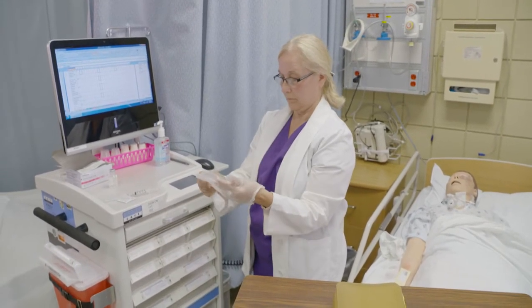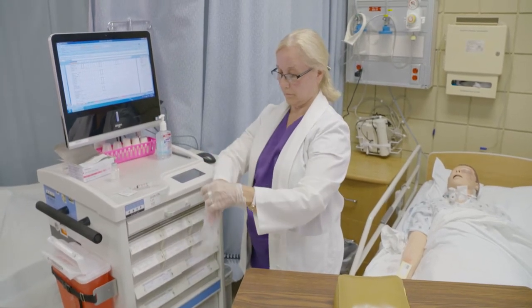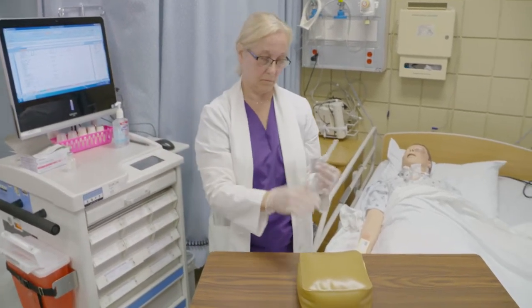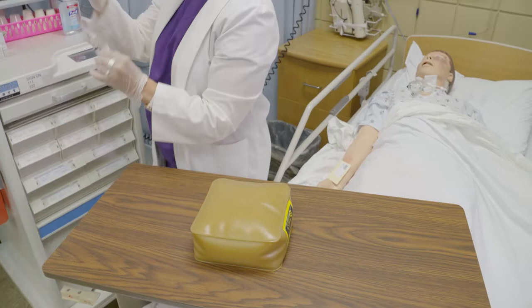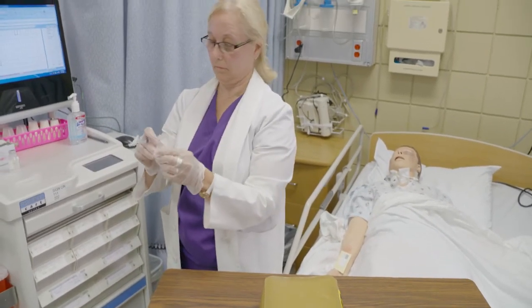Select appropriate site for injection. Please refer to the end of this video for information about correct injection sites. Palpate for masses or tenderness. Hold the syringe in your dominant hand, take off the cap. Make sure the bevel is upward.